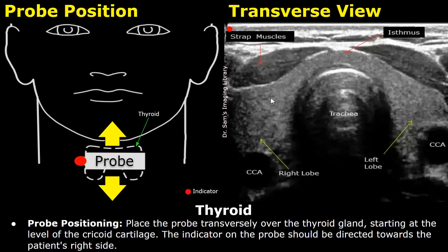The thyroid is seen in the transverse plane. The right lobe of the thyroid will be on the left side of the image, and the left lobe will be on the right side of the image or screen. The isthmus will always be seen at the upper half of the image, and these are the strap muscles.